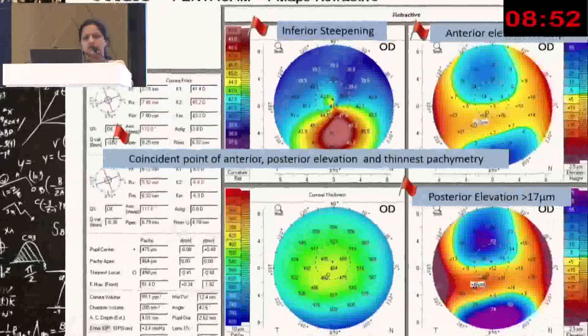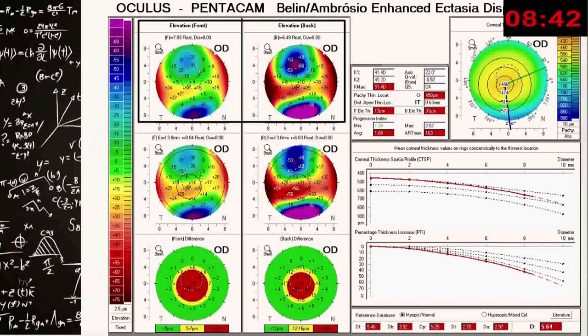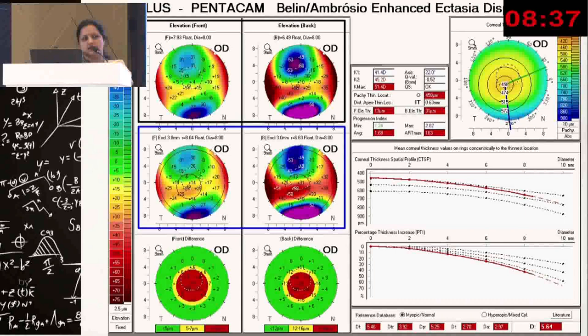Coming to the Belin-Ambrosio display, we have the first two maps showing us the anterior and the posterior elevation, which is based on the best fit sphere. The second two maps show us the enhanced best fit sphere, the elevation based on that. And the last two maps show us the difference between these two.